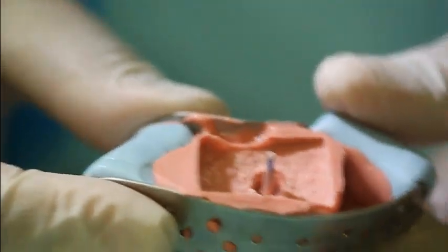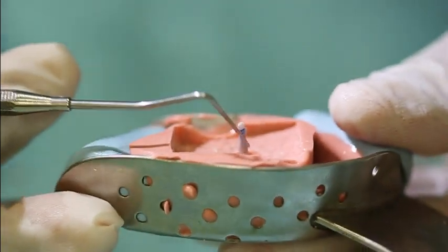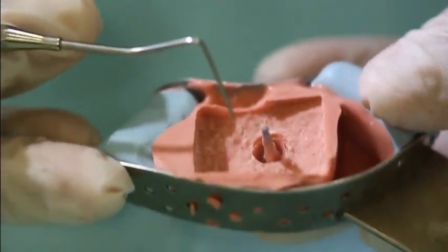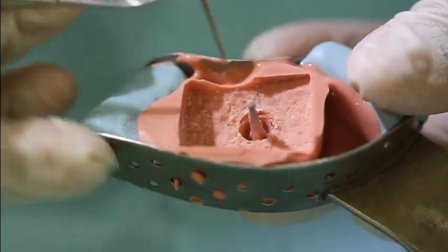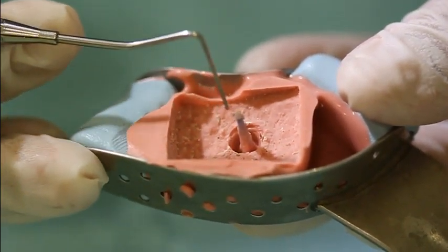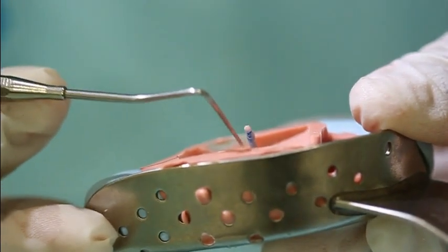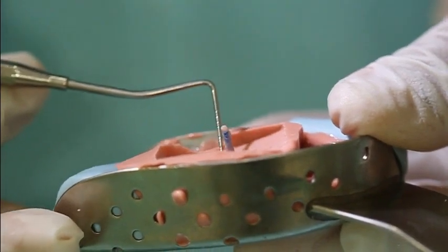When you have your impression done, you need to check that all the margins are recorded, and that you have a thin layer of impression material on the impression post. Make sure there are no bubbles around the margins.